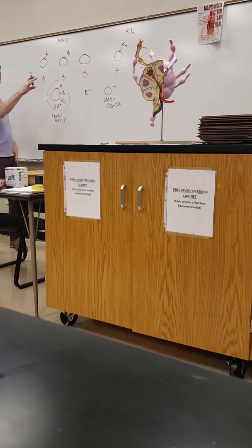Now when it comes to those blood type tests, there's a couple of ways to do them. I'll either use a photograph, or a representation of one, but whatever. We had the fake blood ones, which I don't know if you've seen them, but they had like an A, a B, and an RH. They might have called it D or something.